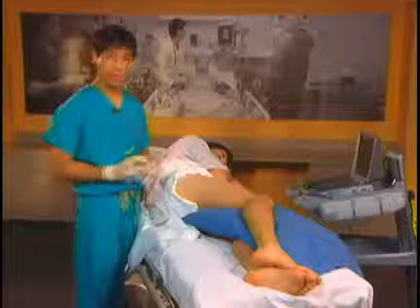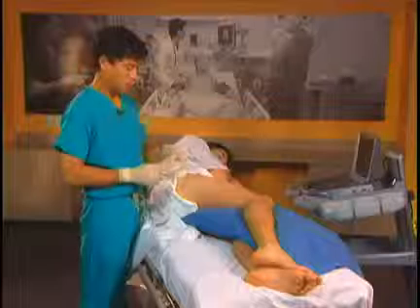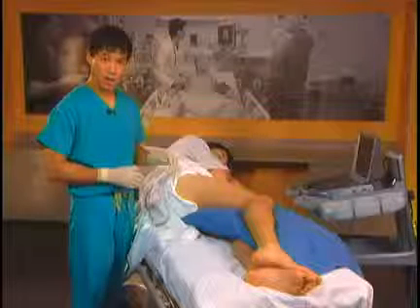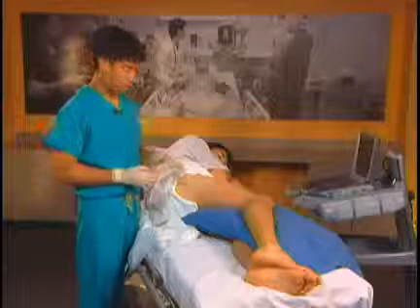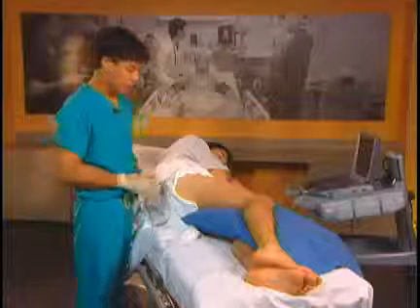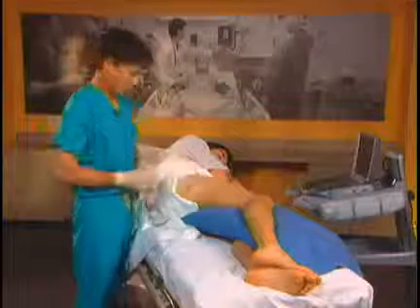about nerve ischemia. You may also get the posterior femoral cutaneous nerve of the thigh, which comes off very high on the sciatic nerve, and it's also medial to the sciatic nerve as well, high up. This way you can cover any kind of pain of incision in the upper thigh area.